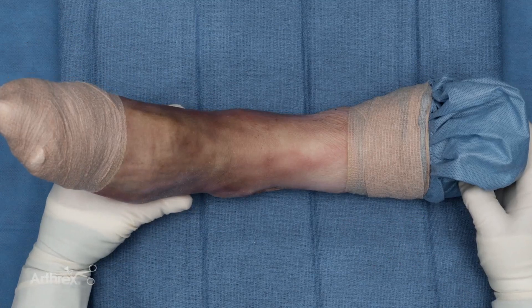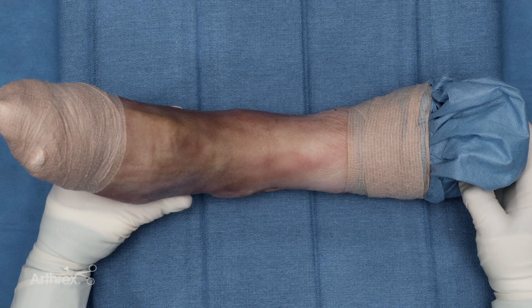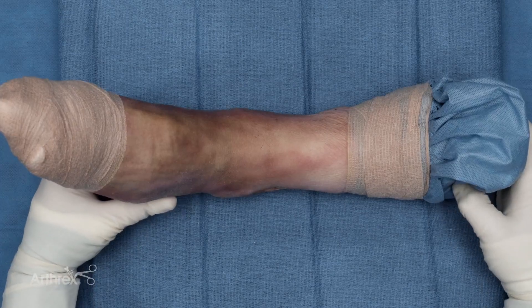One of the major benefits of intramedullary nail fixation using the Fibuloc for an ankle fracture is the ability to obtain anatomic reduction through small incisions and then stabilize the fracture through the Fibuloc.